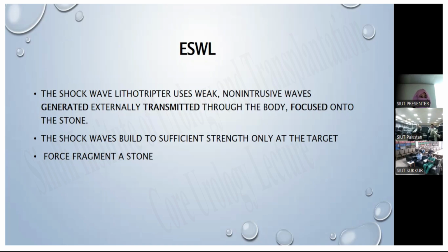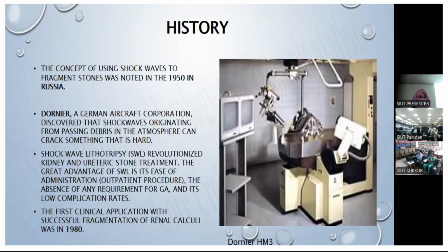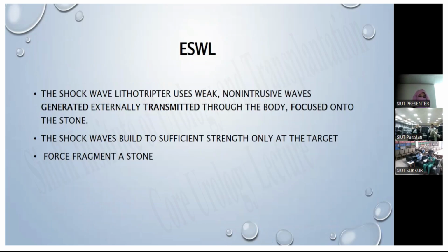So there has to be a medium for transmission of the wave, which is the transmitter, and then the focus point, the place from where the wave generates, is called the F1 point, and then there is a reflector, which is a mirror, and on the basis of difference of mirror, there are different types of devices.